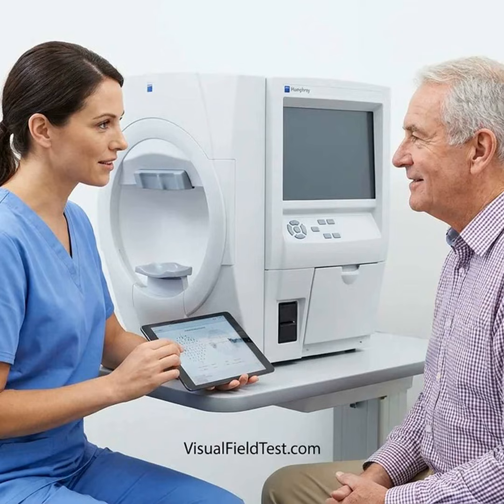A short practice exercise can reduce the unfamiliarity that makes the first test stressful. A practice exercise should be clearly labeled as training only, not as a clinical result. In a study of 55 healthy adults with no previous perimetry experience, the median test duration decreased from 5.7 minutes during the first test to 5.3 minutes during the second test. False negative responses also decreased from a median of 2% to 0%. Sensitivity increased during the second test, particularly in peripheral locations. Practice should be brief. A full additional threshold test may create fatigue and may alter the patient's performance through learning.